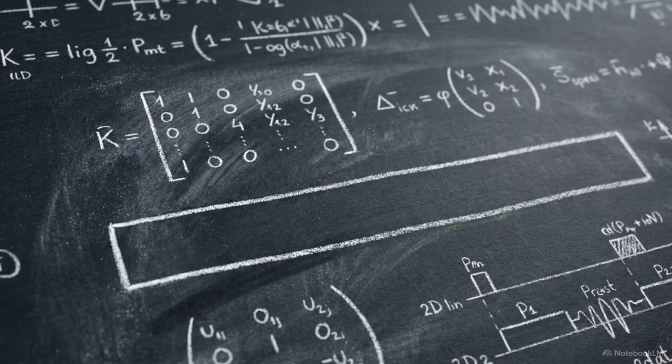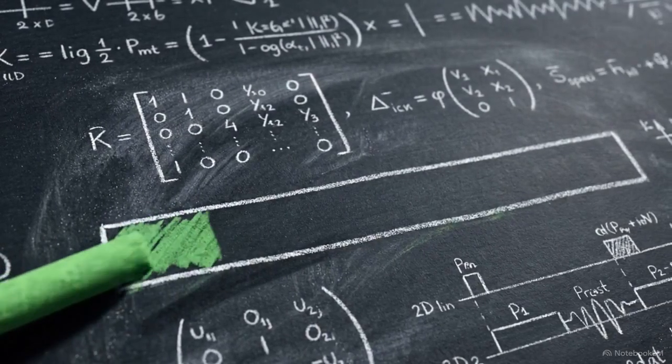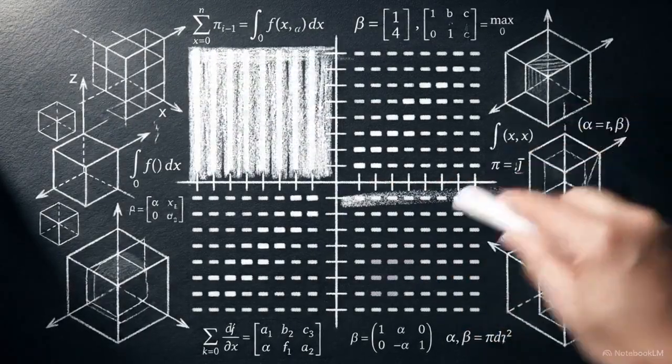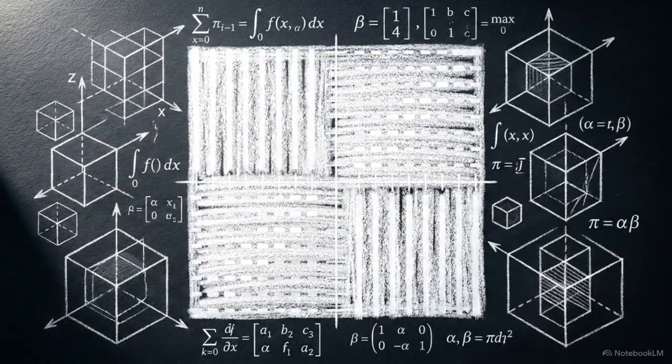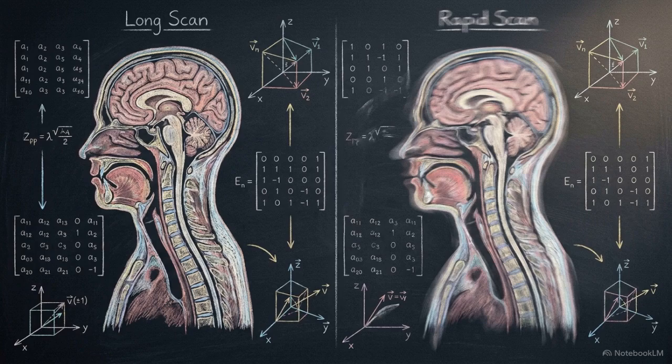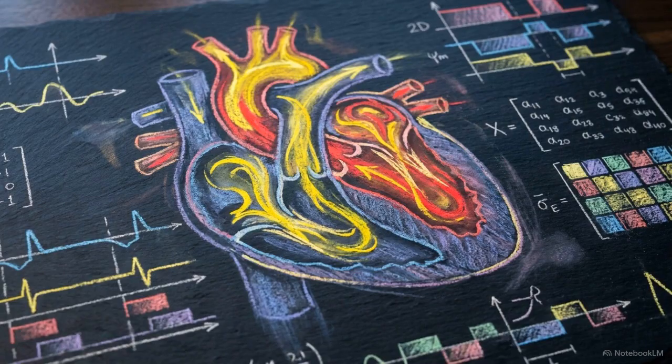The HASTE sequence takes this logic to its extreme. Using a massive echo train length, often over 200, and half Fourier extrapolation, HASTE fills the entirety of K-space in a single cycle. This allows for ultra-fast, heavily T2-weighted imaging, which is the standard for MRCP studies. By utilizing a chain of 180-degree pulses, TSE transforms physical dead time into rapid data acquisition, sacrificing some contrast purity for significant clinical speed. Scenarios like dynamic, contrast-enhanced T1 imaging require even faster acquisition, demanding ultra-short TR times.